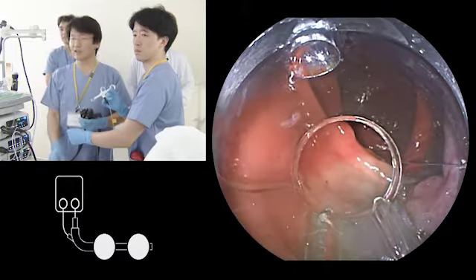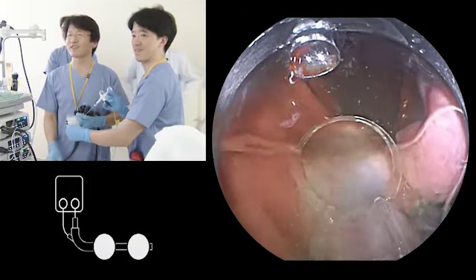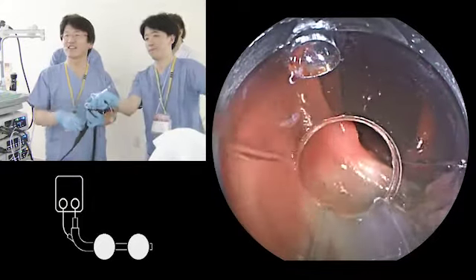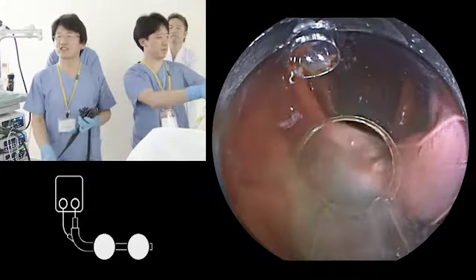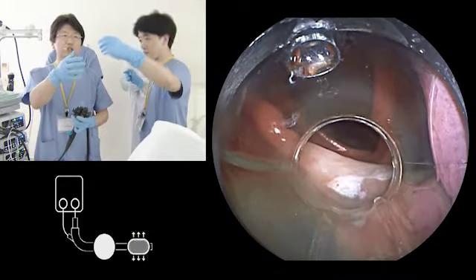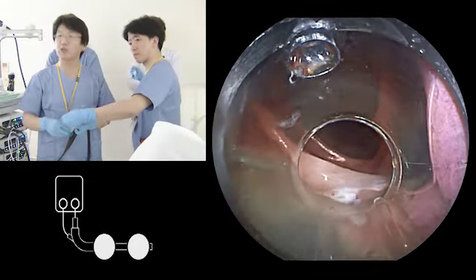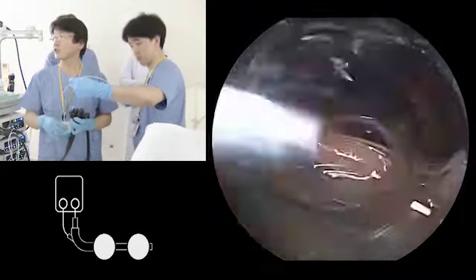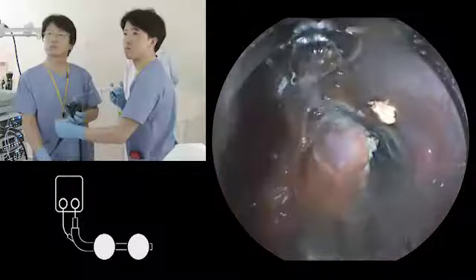Okay, then you can move to another room. Okay, so let's inject. And leaving this intact mucosa, I can add injection anytime, and I can make a very good condition anytime. So anytime you can go, okay?